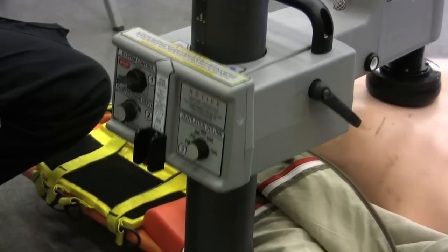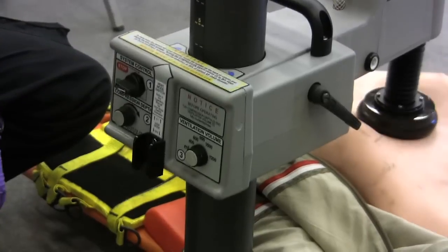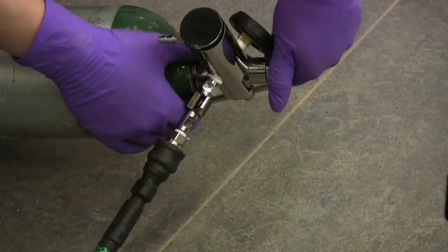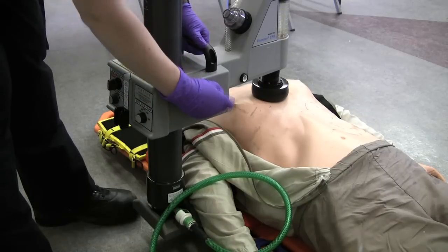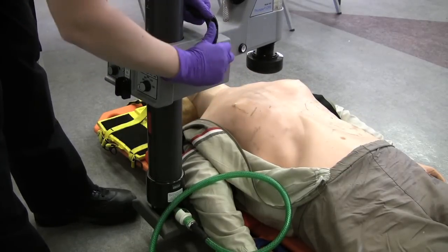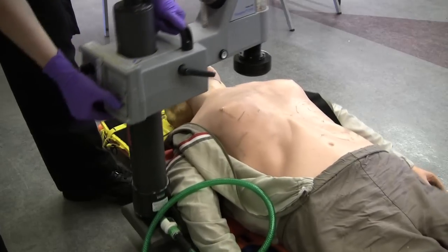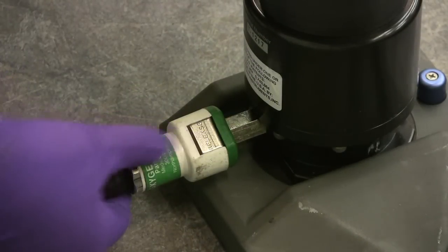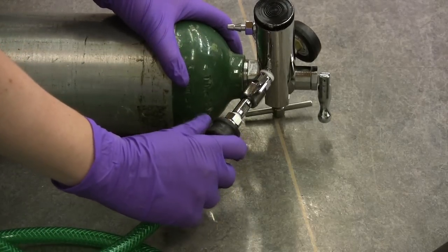If you want to stop compressions, you can just come to system control and turn the knob. If you want to continue compressions, you just turn it again and go straight to run. If you want to discontinue the thumper, you can go ahead and turn off the oxygen, loosen the arm locking knob to lift it up, pull the base out of the thumper backboard, disconnect the oxygen tubing from the thumper by hitting the release button, and disconnect the oxygen tubing from the oxygen tank by just pulling back.